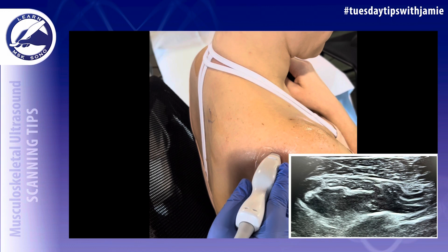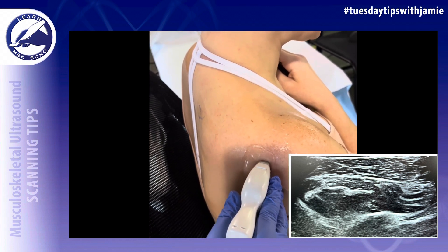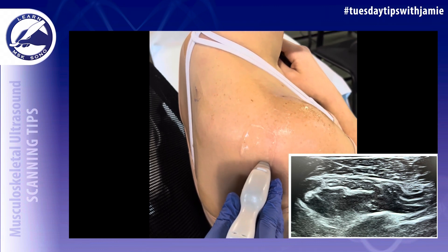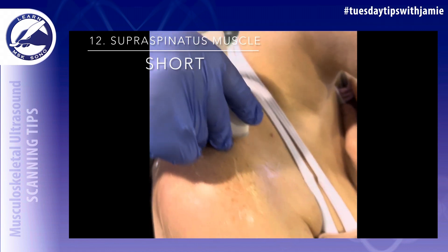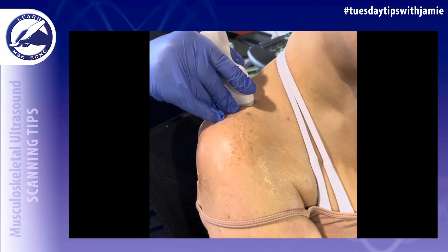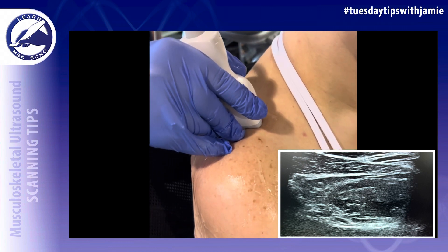Image the infraspinatus muscle in the short axis, then slide down to image the teres minor. Then slide over the scapular spine and slightly medial to image the supraspinatus muscle in the short axis.